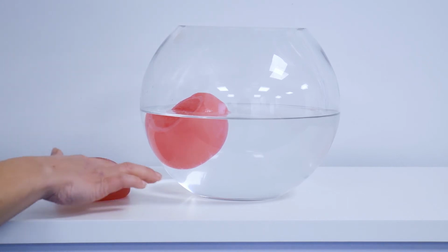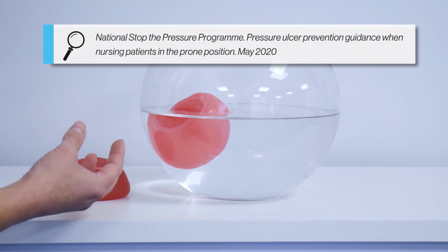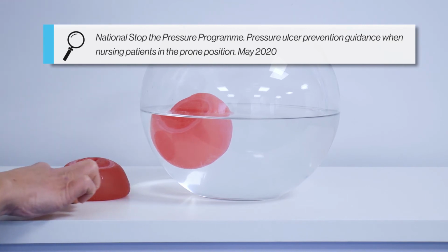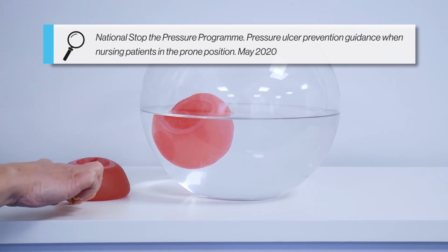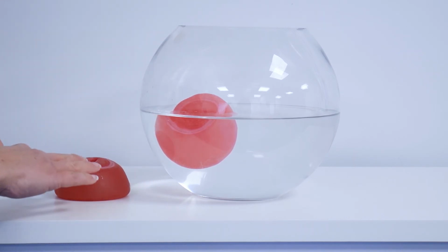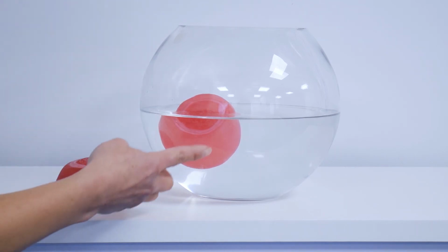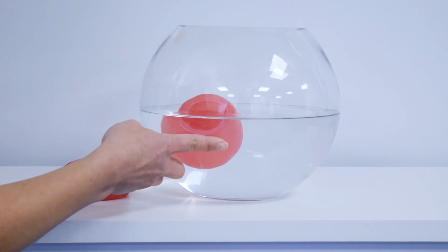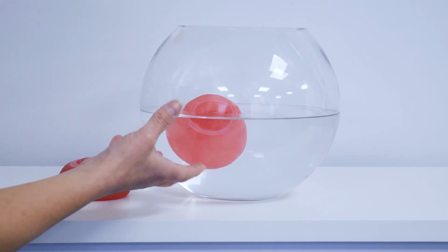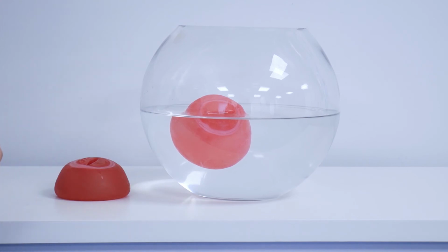If we take this as a demonstration of a tissue or a cell, when cells are loaded heavily for a short period of time or loaded for a prolonged period of time, the cell can become damaged. And here this one has got a flat bottom. If a cell becomes damaged, all the cells surrounding this cell now have to take additional load. Where a cell is placed in a fluid environment, you can see that the structure of the cell is completely unflattened. It's kept in its natural position. This means that the cell is less likely to become damaged.